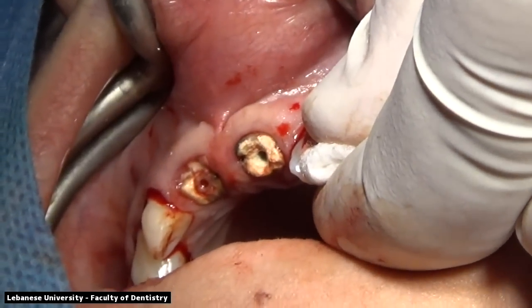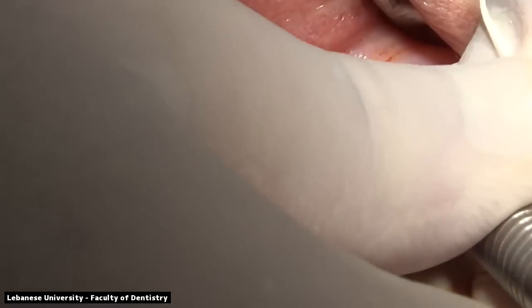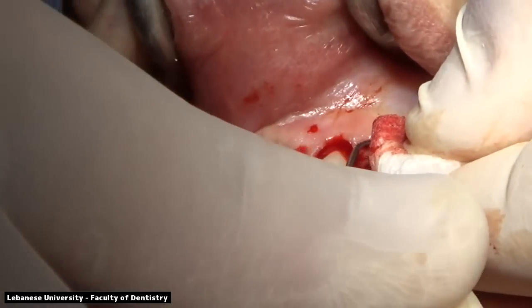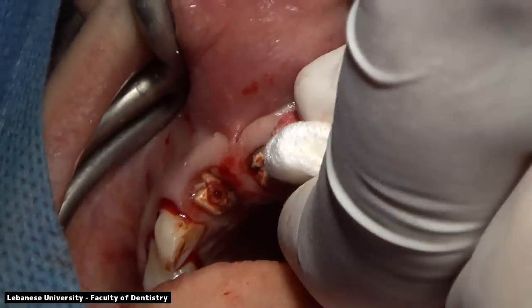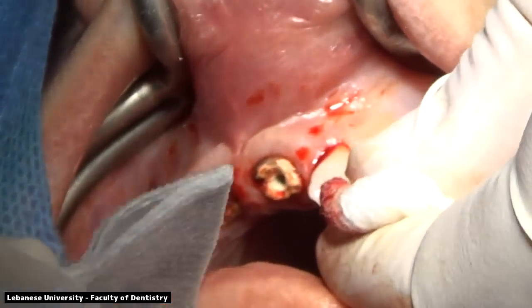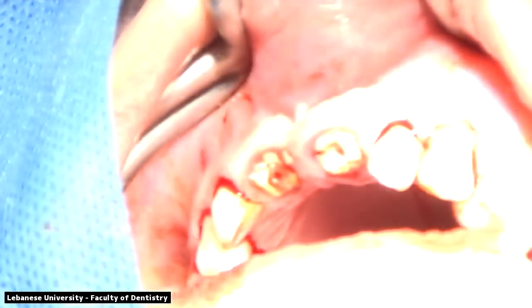We're just in our last step of the removal of the excess tissue. The gingivectomy procedure is now completed.